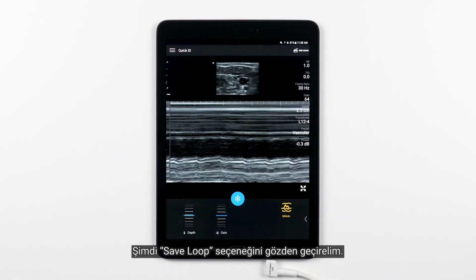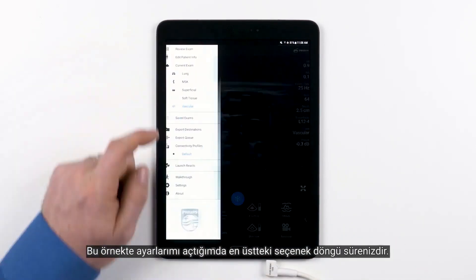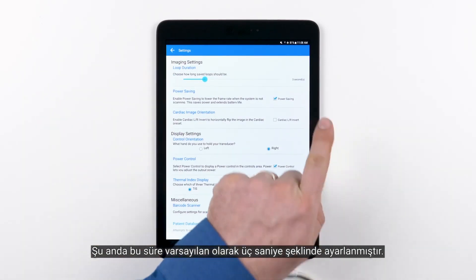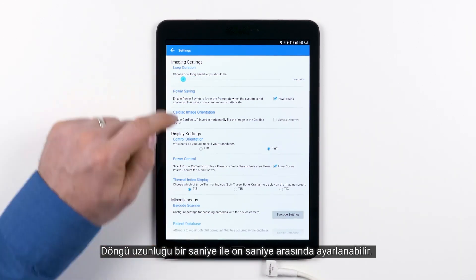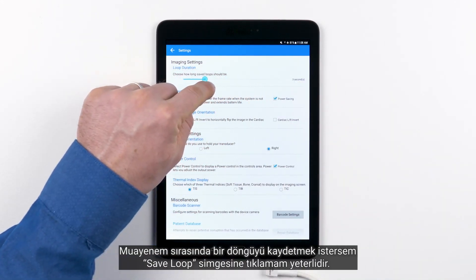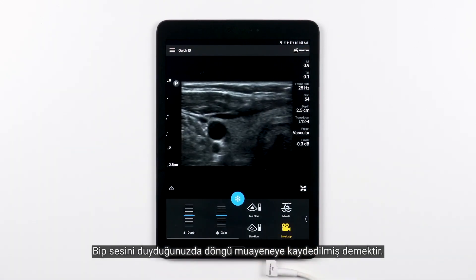Let's review the Save Loop option. The length of the video loop that is saved is set within the settings of your Lumify system. If I open my settings, the very top option is your loop duration. Right now, it is set to 3 seconds, which is the default. Loop length can be set from 1 second to 10 seconds. If during my exam I want to save a loop, I can just tap the Save Loop icon. Once you hear the beep, that means your loop has been saved to your exam.